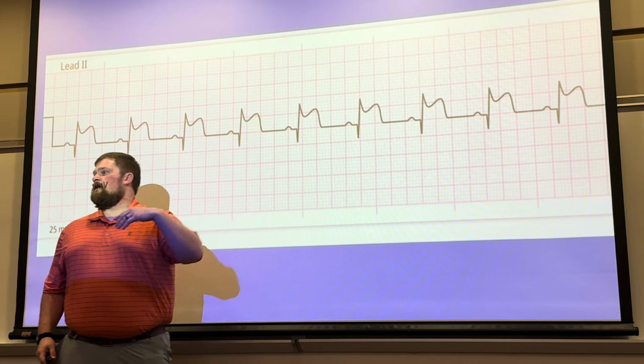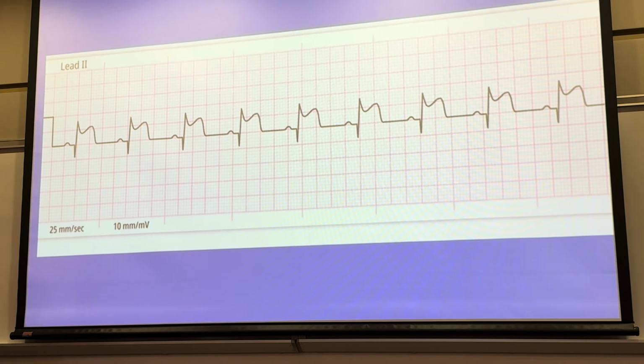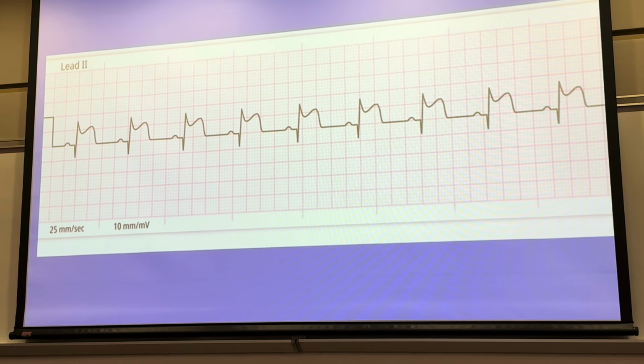All right. You got the tombstone, you got the fireman's hat, you got the sharp tooth, the oven mitt, whatever you want to commit to your memory. But this is a STEMI. When you do an EKG quiz on your initial hire, because everybody will, and you'll probably get it yearly, they're gonna have several STEMIs on there. Okay.